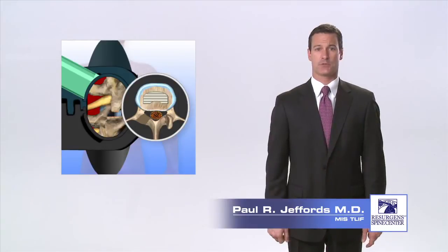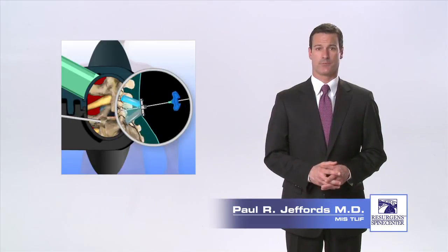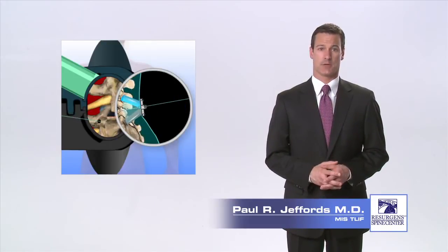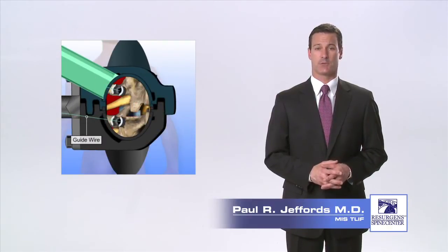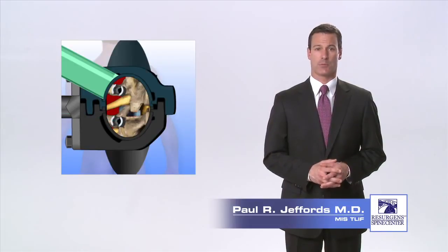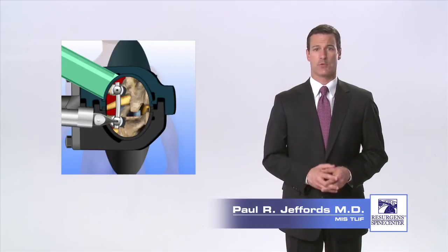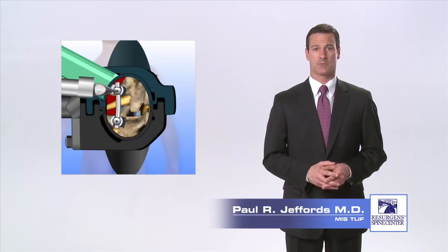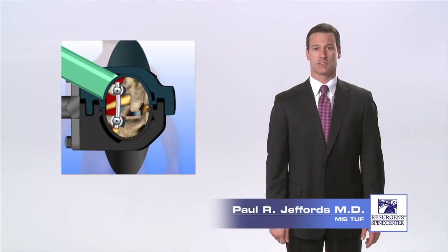Next, titanium screws are placed into the vertebra above and below the disc through columns of bone called pedicles. Guide wires are placed into the pedicles using x-ray guidance, and screws are placed over the guide wires and screwed into the pedicles. After the screws have been placed, the guide wire is removed. A rod is then positioned between the screws and fastened in place. The rod and screw instrumentation provides stability to the spine and prevents the vertebra from moving while the bone graft fusion takes place.